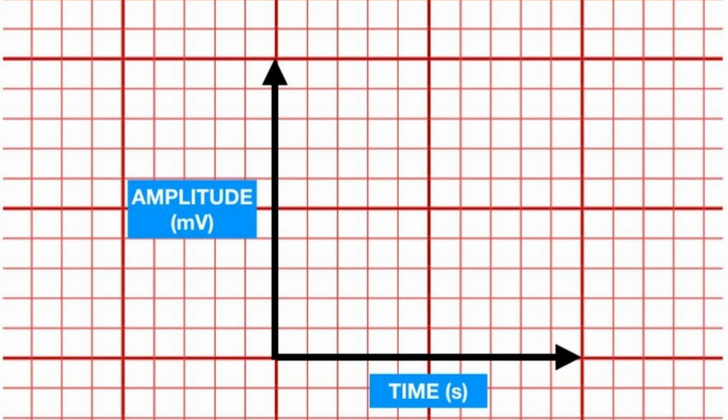As you can see, ECG paper consists of squares. These squares are large squares and small squares. Each large square consists of 5 small squares, horizontally and vertically. Now, the squares are not just for looks. They are used specifically to measure something. It's like a ruler for us to measure stuff.